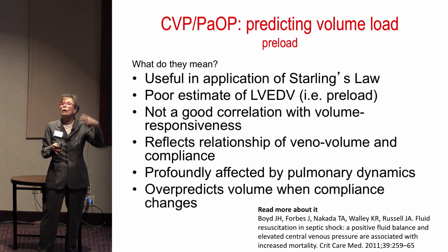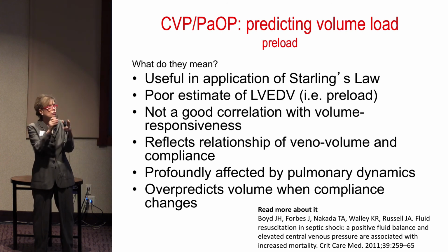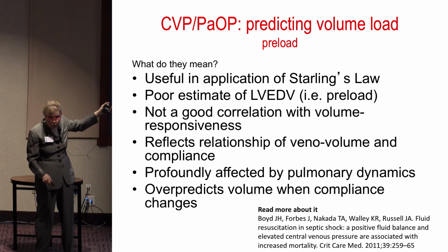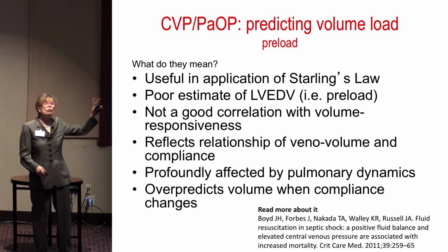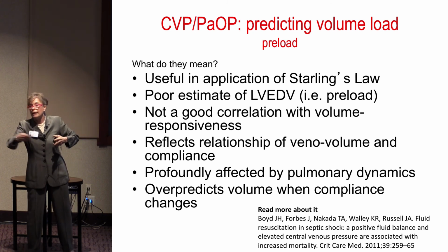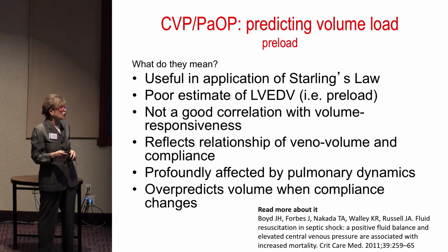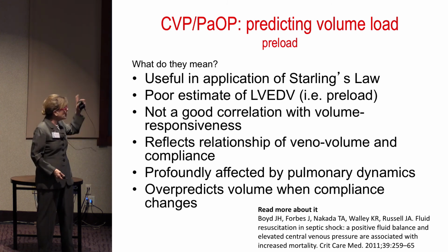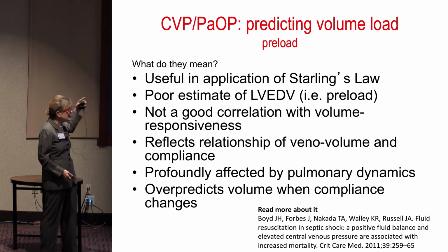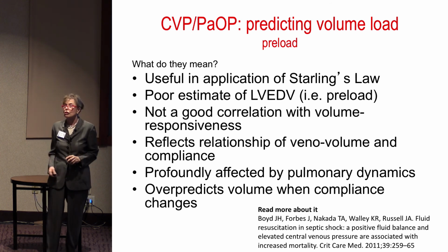So in all of the concurrent literature that we're looking at now that actually guides us to appreciate, filling pressure is not volume. Okay, but that's okay. We can still use the filling pressure and correlate it to our left heart ejection to guide us in therapeutic evaluation. And most of us are doing that today. That's a basic Frank-Starling curve. But we know that this is not the way we should be measuring volume by filling pressures.